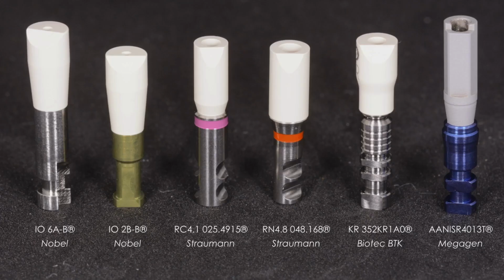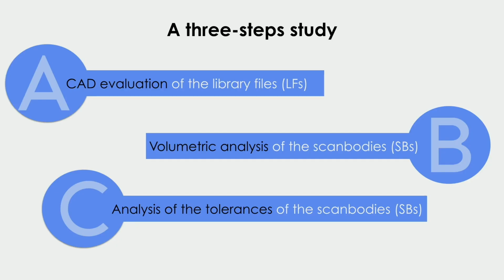This is the whole set of samples. Of course, we bought several pieces per type, so in the end we investigated 30 pieces in all, 5 per type, 5 times 6 is 30. And the study was based on 3 steps. First, we measured the library files as reference.